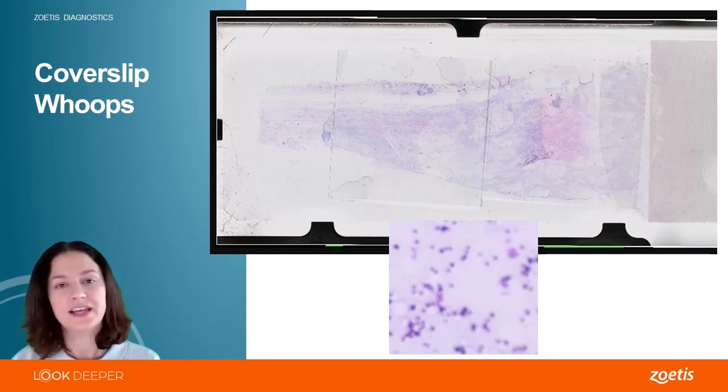I can look on the slide to see if there are maybe more cellular areas. So I get a complete overview of the slide that you scanned and not just your scanned area, which I think is so critical for helping troubleshoot. So in this case, I look at the smear, I look at the sample, and in the little square, you can see how fuzzy that is. I see that there are cells there, but I just can't tell why.